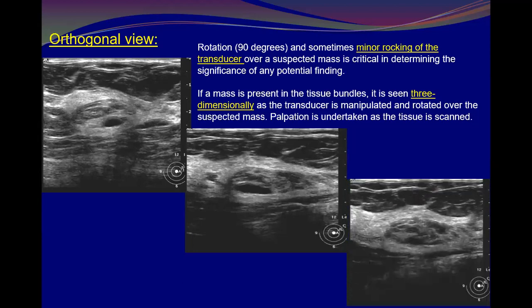So we start to see it, and here more obvious. There is a probably benign lesion, which was fibrocystic changes within the breast. Yeah, like a hamartoma, or fibrocystic changes sometimes. It came like this, and hamartoma or fibroadenolipoma also has the same appearance.